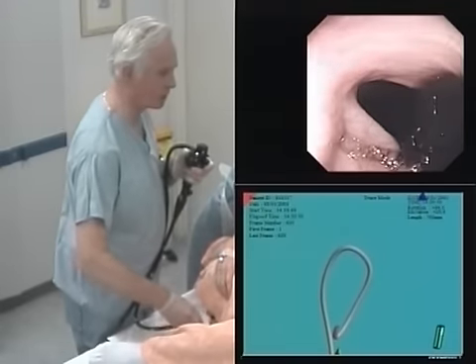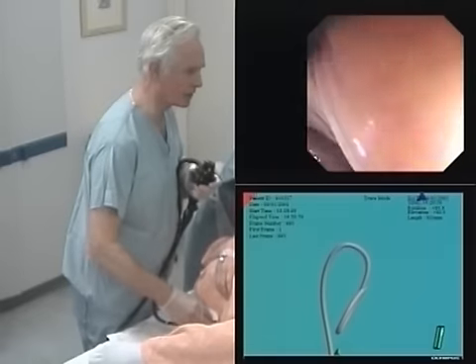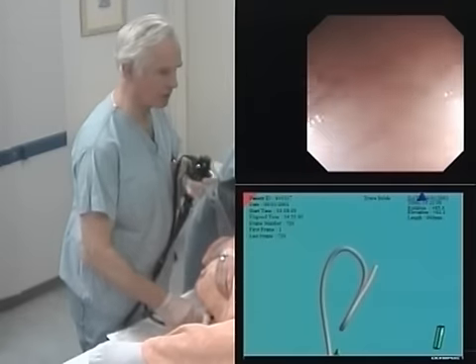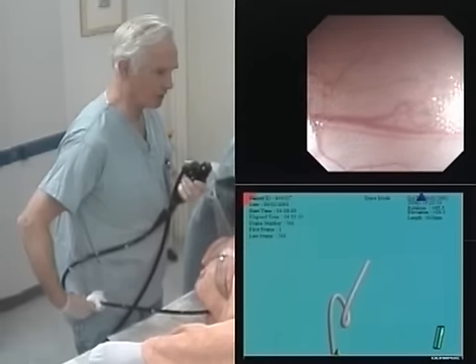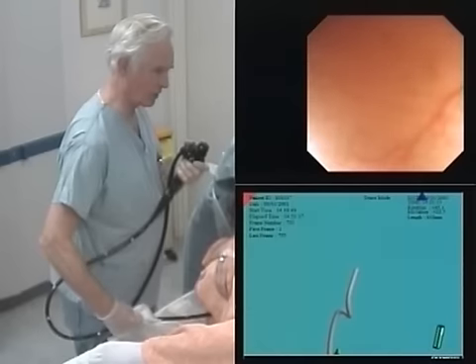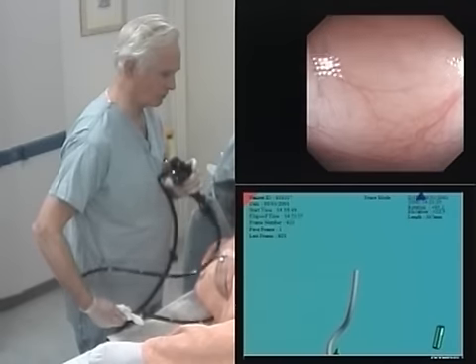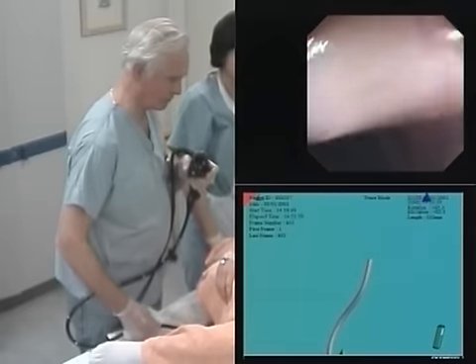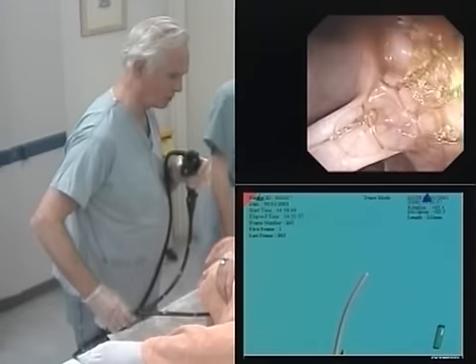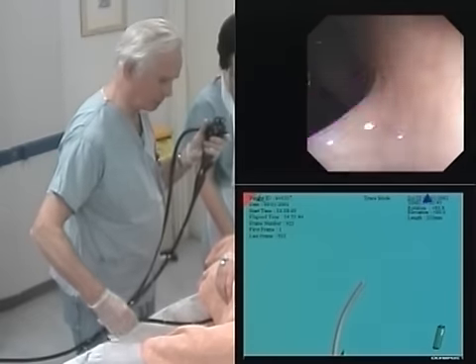It was very long and wobbly last time. So that's quite a jumbo loop. Somewhere about here I'll pull back. Is that hurting you much at the moment? Yes, it is — okay, we'll get it back. I've just done a push through there and I can pull back. And that's actually a counterclockwise twist, quite interestingly. So suctioning it. It was because it was pretty tough last time that I decided to go for broke.